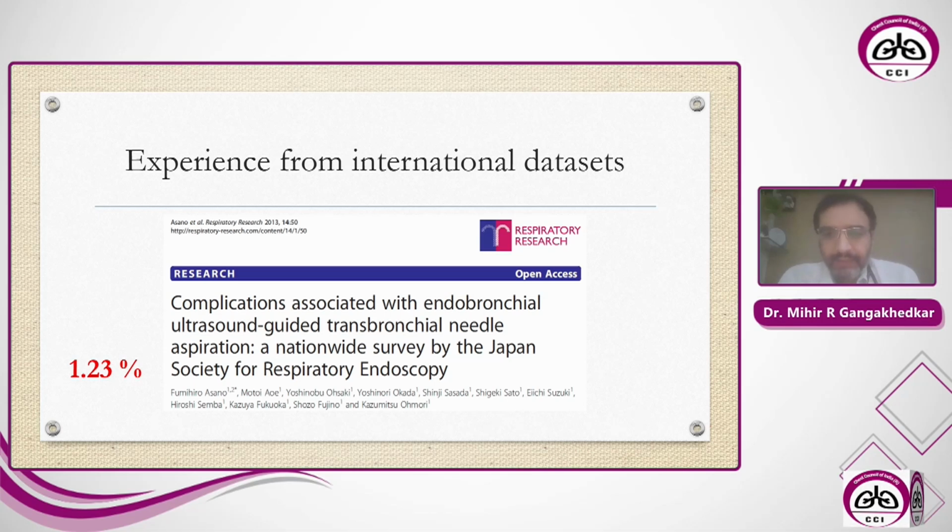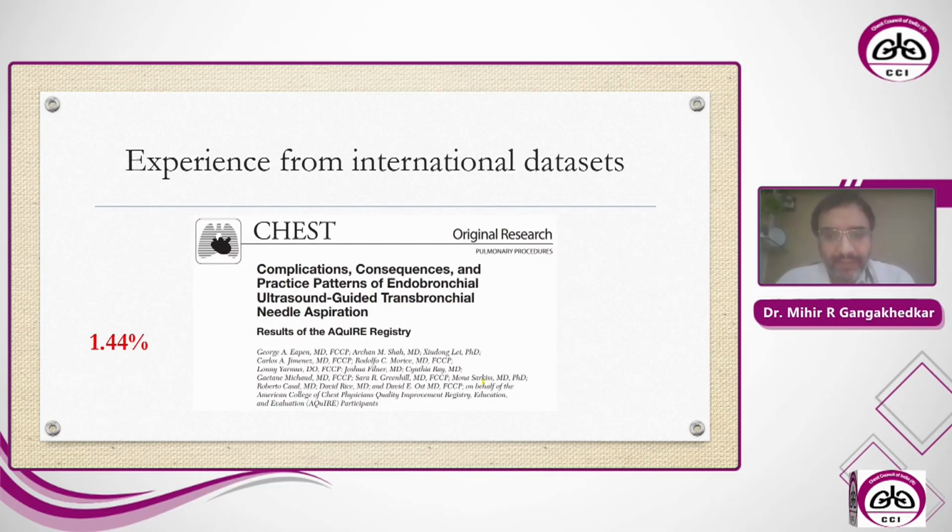There have been several international data sets looking at complications related to EBUS, and this was one of the earliest ones in 2013 when Asano and colleagues produced this paper, where they looked at nearly 7,000 and more procedures, and the rates are reasonably low, 1.23%.